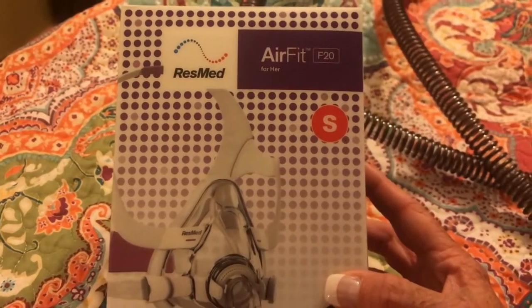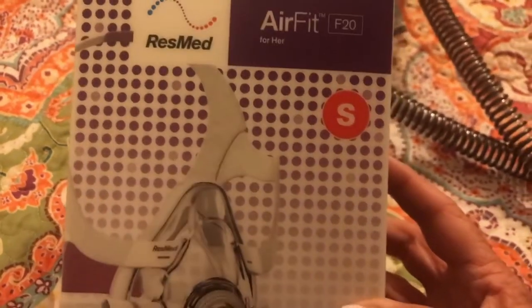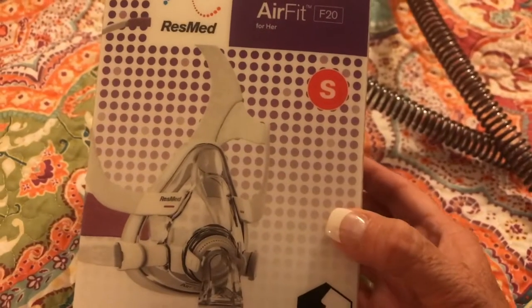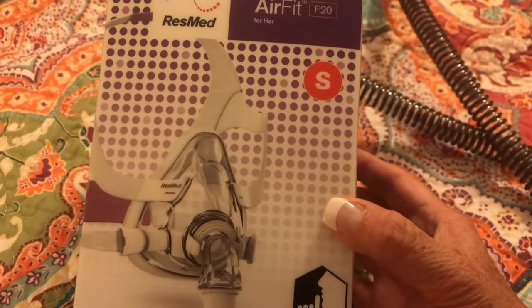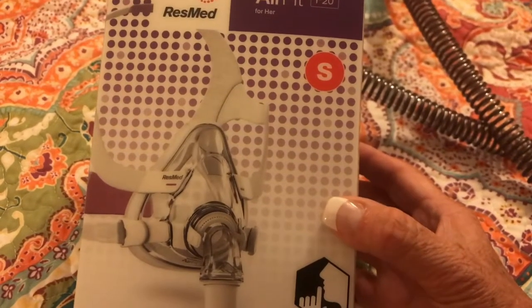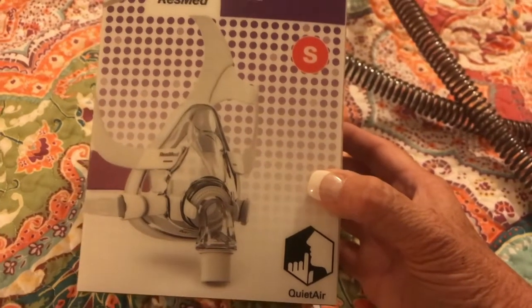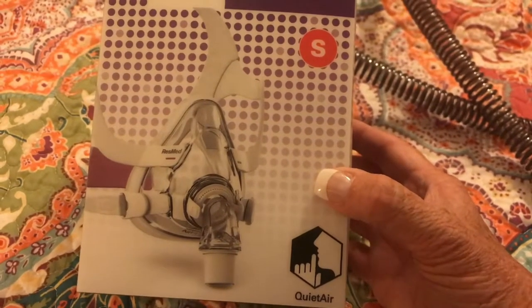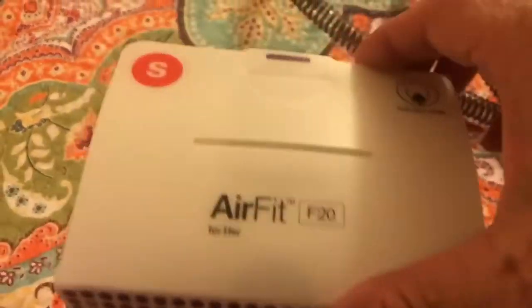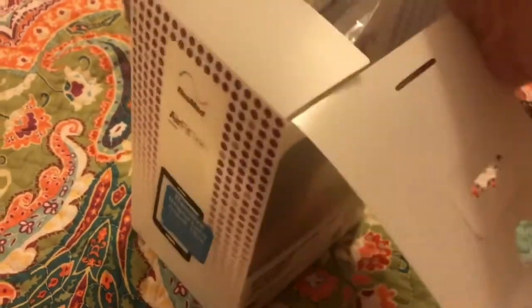This mask is a ResMed — and that's what my machine is — it's an AirFit F20 for her. One thing I didn't want was a full mask, because during my sleep study they put one on that came up the bridge of my nose all the way to the top of my head, and I felt very claustrophobic. But when she put this one on me, I just took myself out of my head. This one doesn't come up my face as much — she said most masks now don't have those stabilizers. She fitted it on my face while I was there, and it seems very quiet.